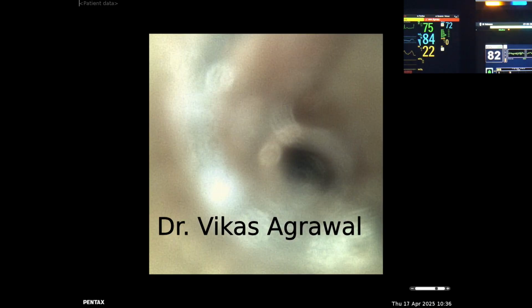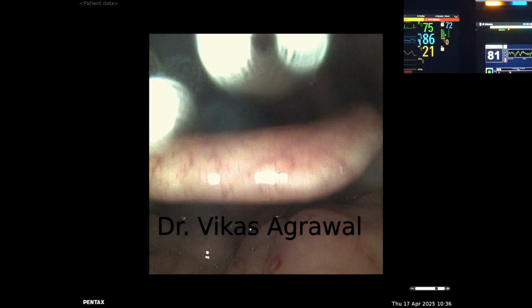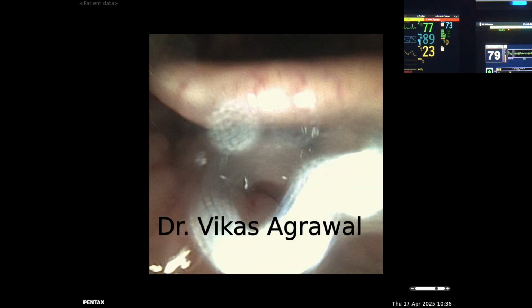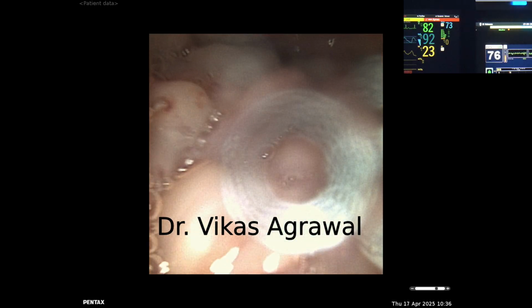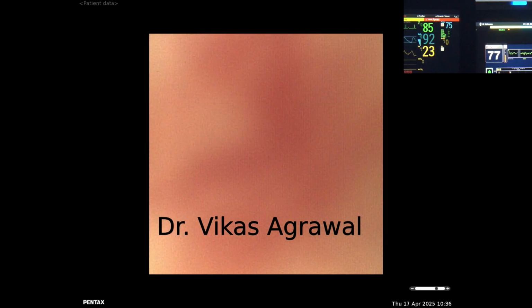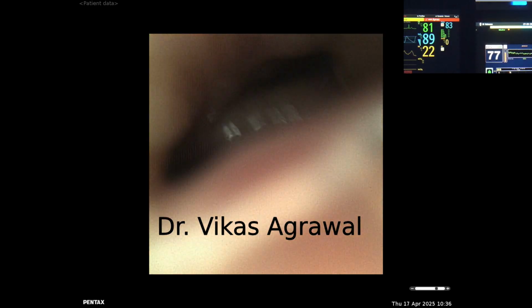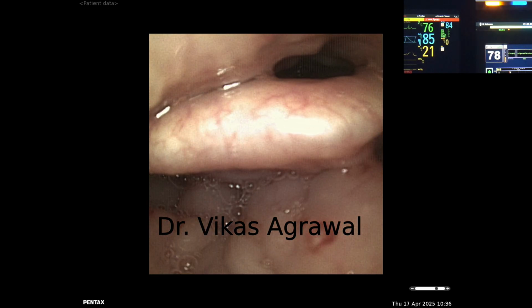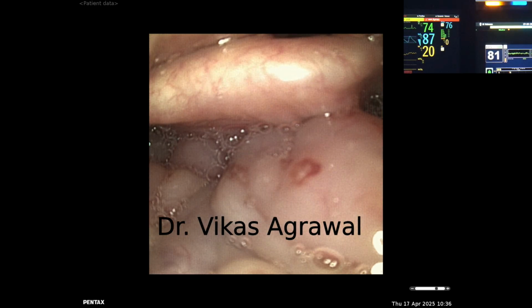Now his mouth is closed. His mouth is still not open. I will still try to keep his mandible fully approximated to the maxilla. So I am now closing his mouth. Can you just hold the mouth properly? Only close the mouth. I'm trying to now close his mouth more forcefully, and still you can see the base tongue and the epiglottis collapsing.